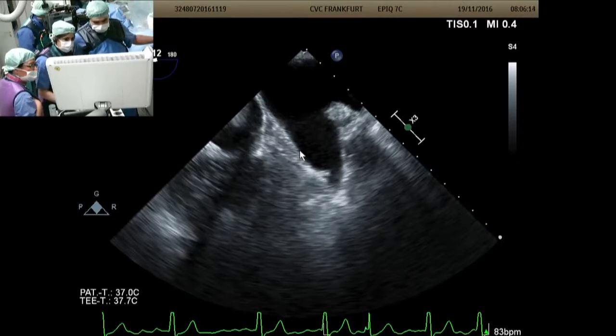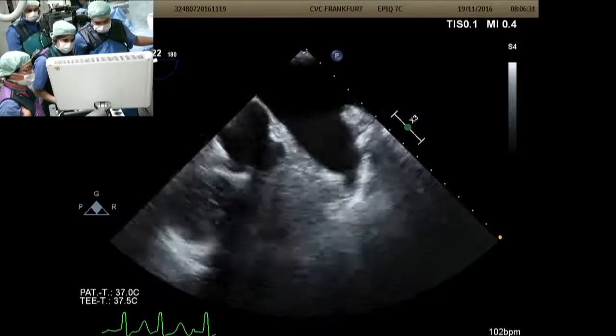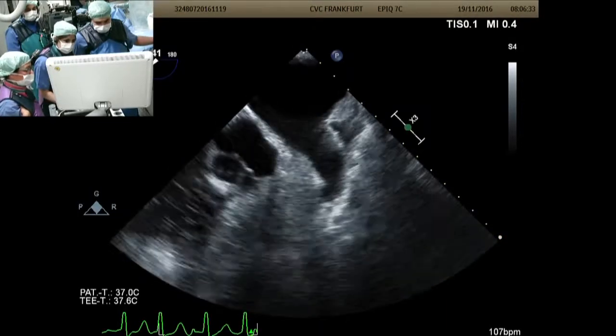Then you see it moves down from the smooth neck almost, and then you get the trabeculations where the appendage starts, so where you'd expect. The circumflex vessel is around this level here. You kind of get a glimpse of it here. And actually, there doesn't seem to be much appendage in this view. So it's looking very interesting. So if I did a couple of measurements here.